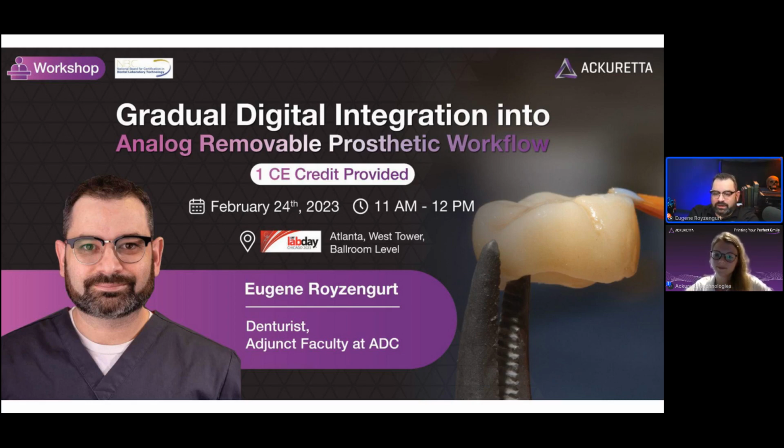I've heard some good things, but I've also heard some things that are not so good. Now, is it because the resins are bad, or is it user error? Like what I was trying to cover before, you have to make sure you have a validated protocol. Maybe you didn't post cure properly, maybe you over cured or under cured. Because if you over cure things, it's just as bad as under curing.